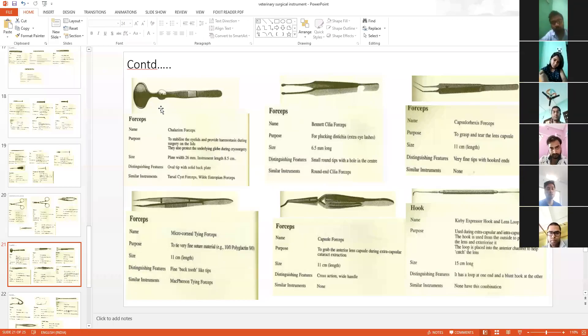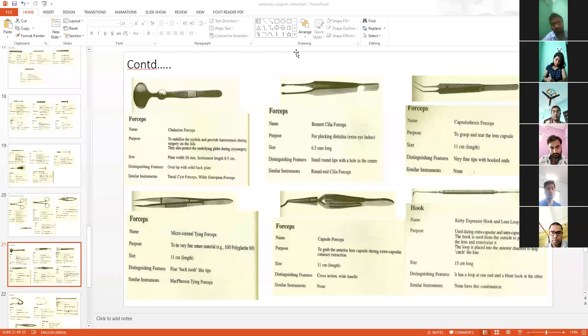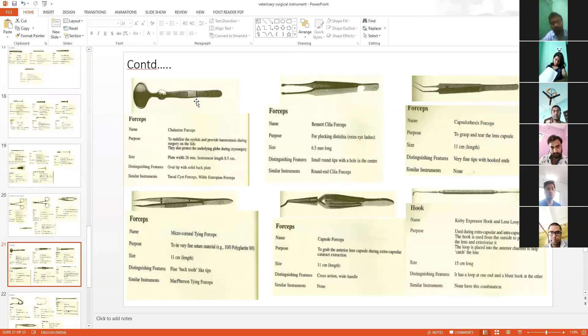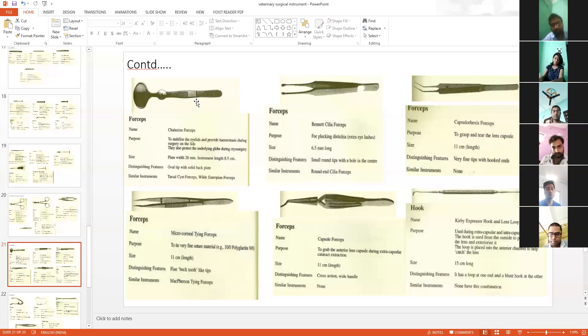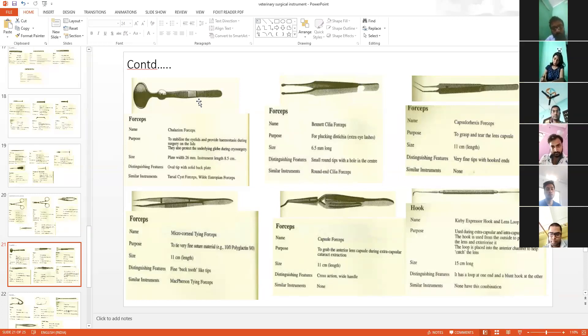This is known as Chalagian forcep. This is very important and is used for the correction of one condition. This is for the eye, specifically for chalazion, which is a type of cyst.